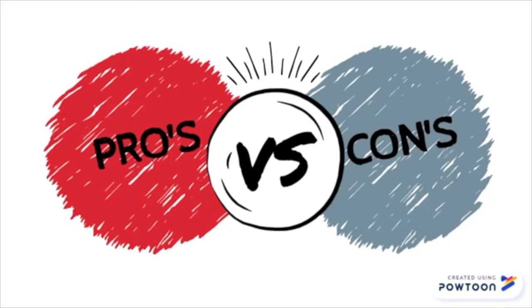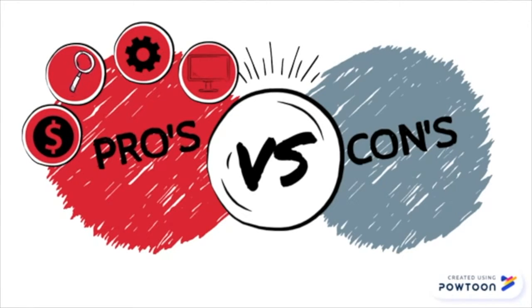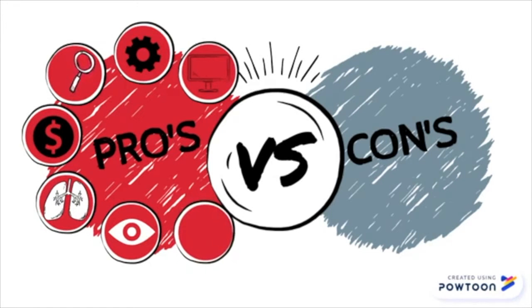Some advantages include: both CMR and CCTA have excellent resolution of 1 mm and 0.6 mm, respectively. All techniques have a relatively simple protocol. All techniques provide a comprehensive and multidimensional exam of function, perfusion, viability and thrombus. Both CCTA and echocardiography are cost-effective for a wide range of medical problems. All techniques provide very detailed images of many tissues. CCTA has the ability to view bones, soft tissue and blood vessels at the same time. Both CMR and echocardiograms have no ionizing radiation.